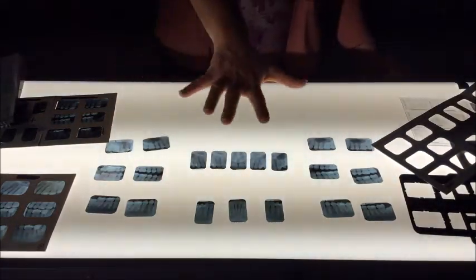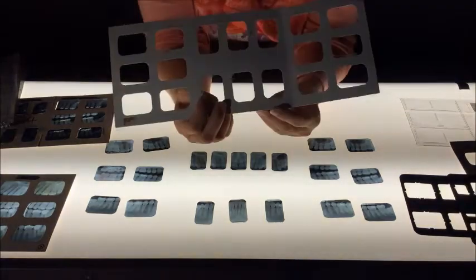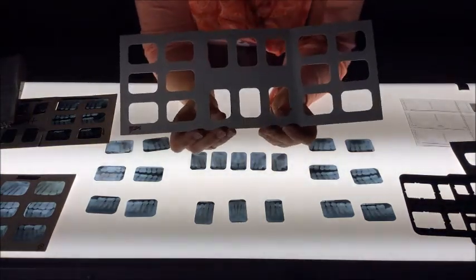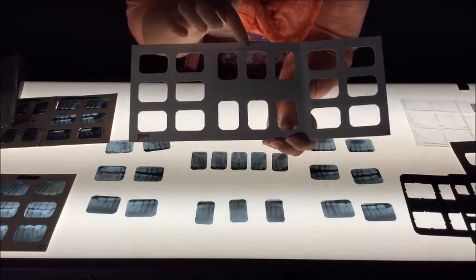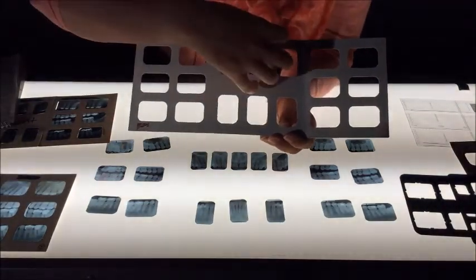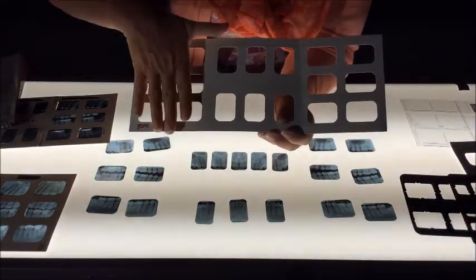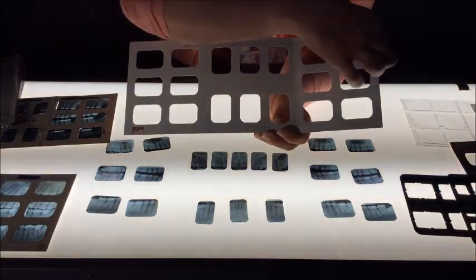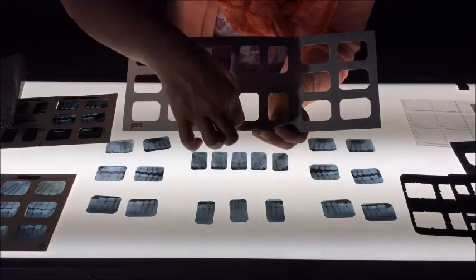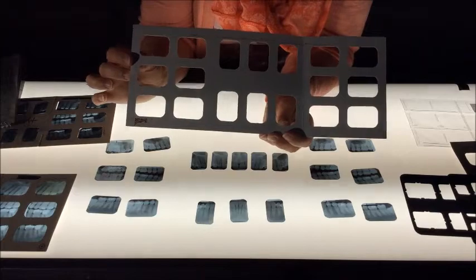Once you have orientated yourself with all of your film laid out on your view box, then you're ready to actually put it into a film mount. I caution you, when you're placing it in the film mount, place the film mount in front of you so that you can see the labeled area. Remember I said to you, anteriors will be placed in the film mount in the center, posteriors on the side. This is the upper jaw, all the maxillary teeth. This is the lower jaw, the mandibular teeth on the bottom of the film mount. The bite wings go in the middle.